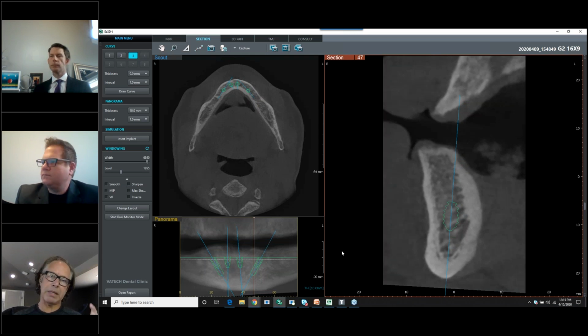And it's more about what's being taught versus the instrument that's being used. So the short and long of it is this. Yes, I will use Vatech because that's been my machine of choice for a number of reasons for the last 7 years. However, if you're not engaged in 3D yet with Vatech, you will still get a big learn out of the session. I hope you come out of it being part of our family, because I feel that it's an incredible family, as I've already said. But if you show up and you're interested in learning 3D, that's exactly what you're going to learn.